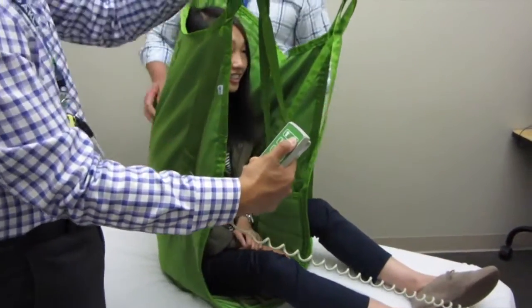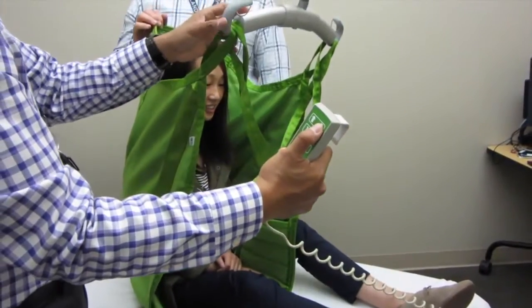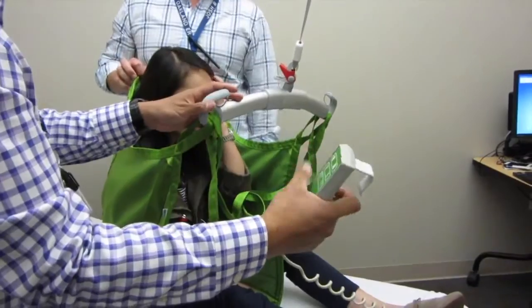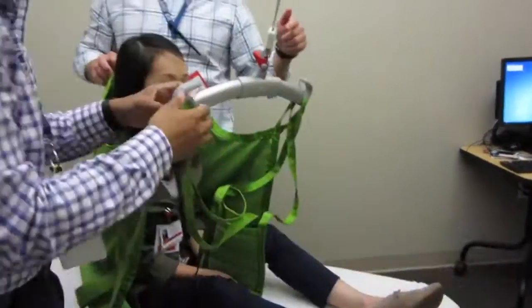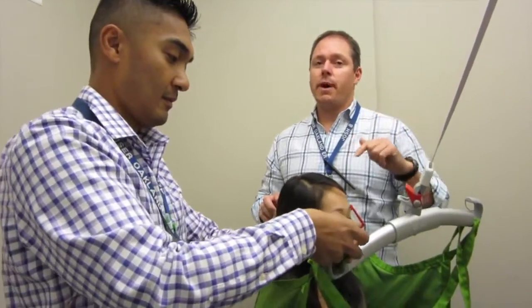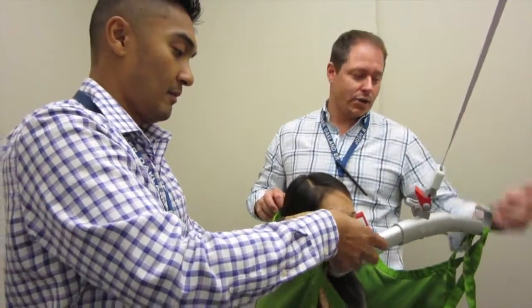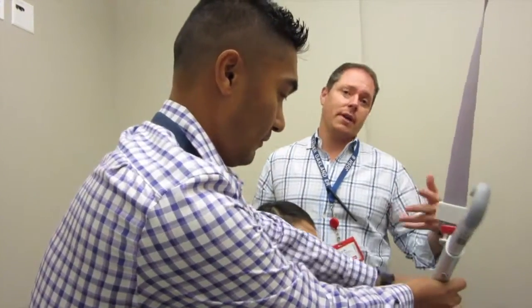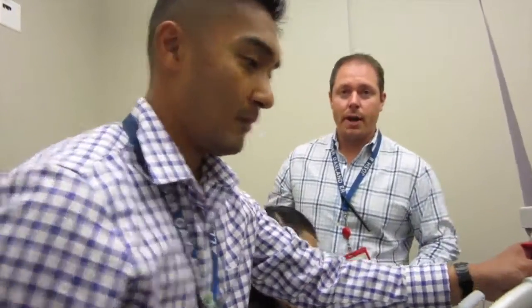And that completes the Golvo lift in-service. 440-pound total rating. We prefer that you use them as much as possible. One thing we wanted to also stress is that you can do a chair to bed, but you can also do a floor to bed or floor to chair using the Golvo as well. It actually has enough reach to get all the way down to the floor, pick a patient up off the floor, kind of like the hover jack, and put them safely on a bed. All right.